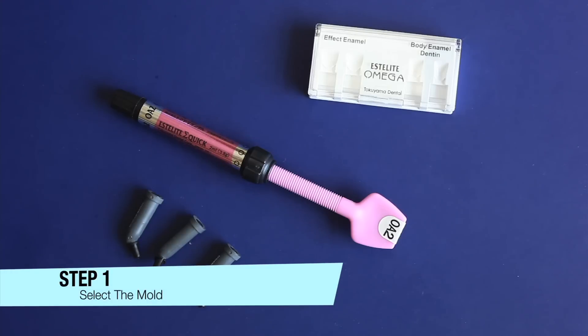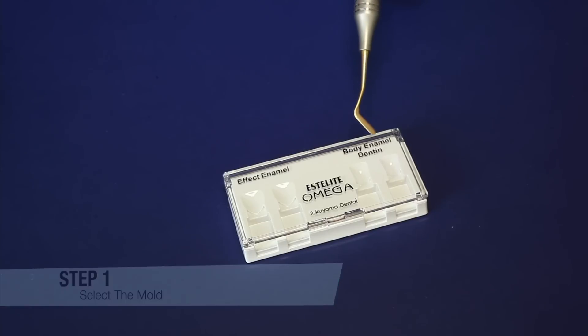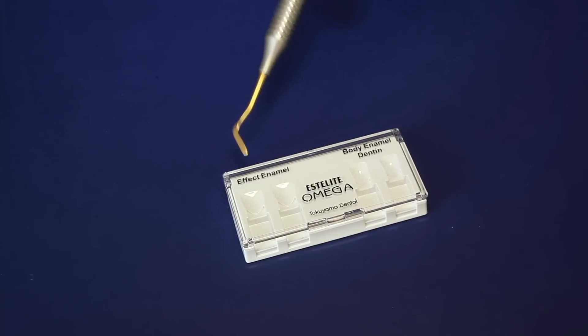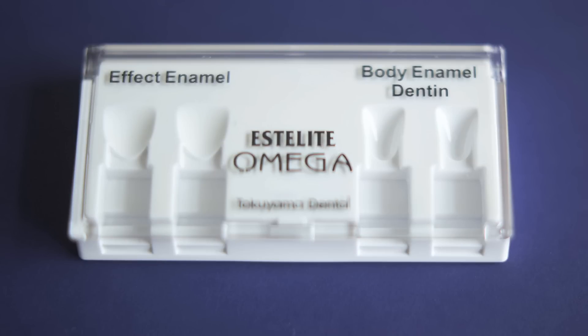Step 1: Select the mold according to the shade type desired. The mold has two types of tooth shapes. The effect enamel molds are wide and shallow and suitable for effect shades. The body enamel and dentin molds are narrow and deep and suitable for enamel and dentin shades.